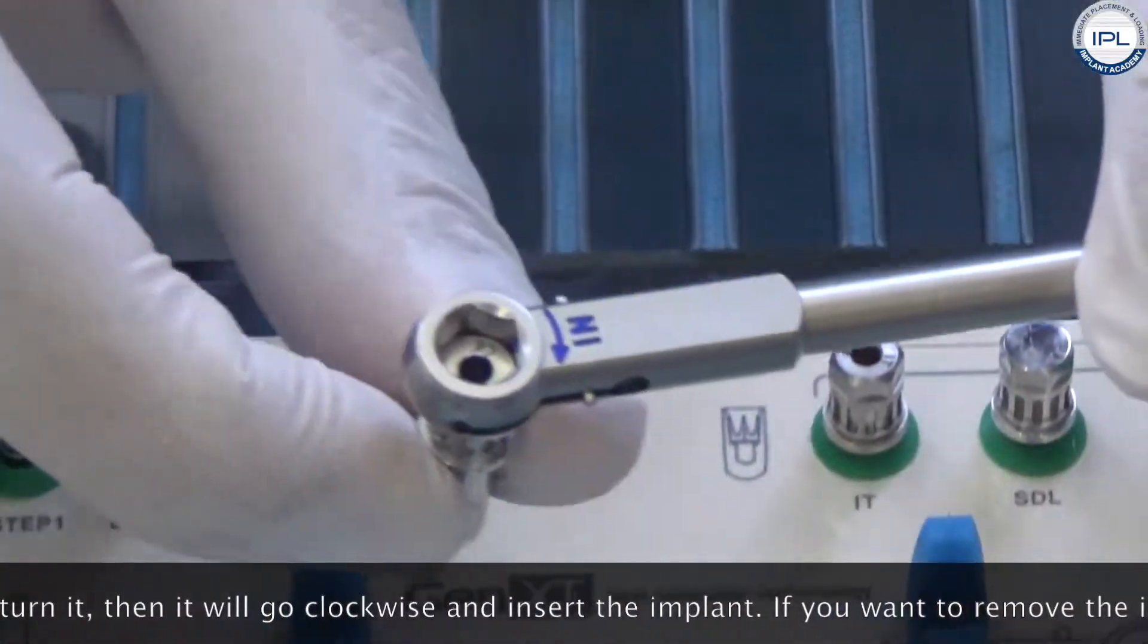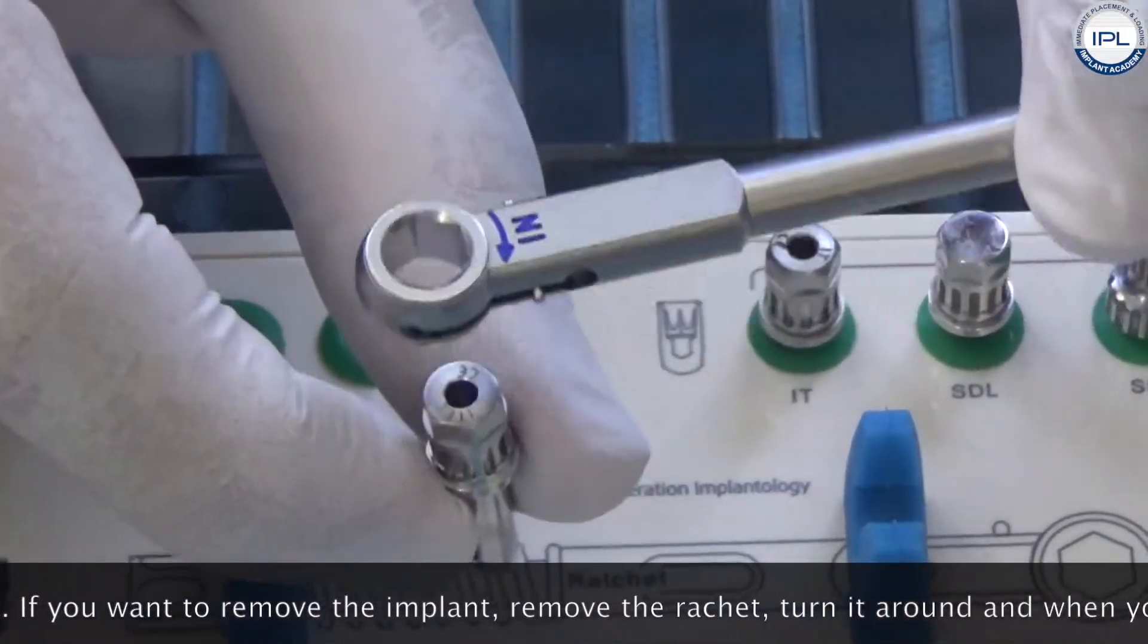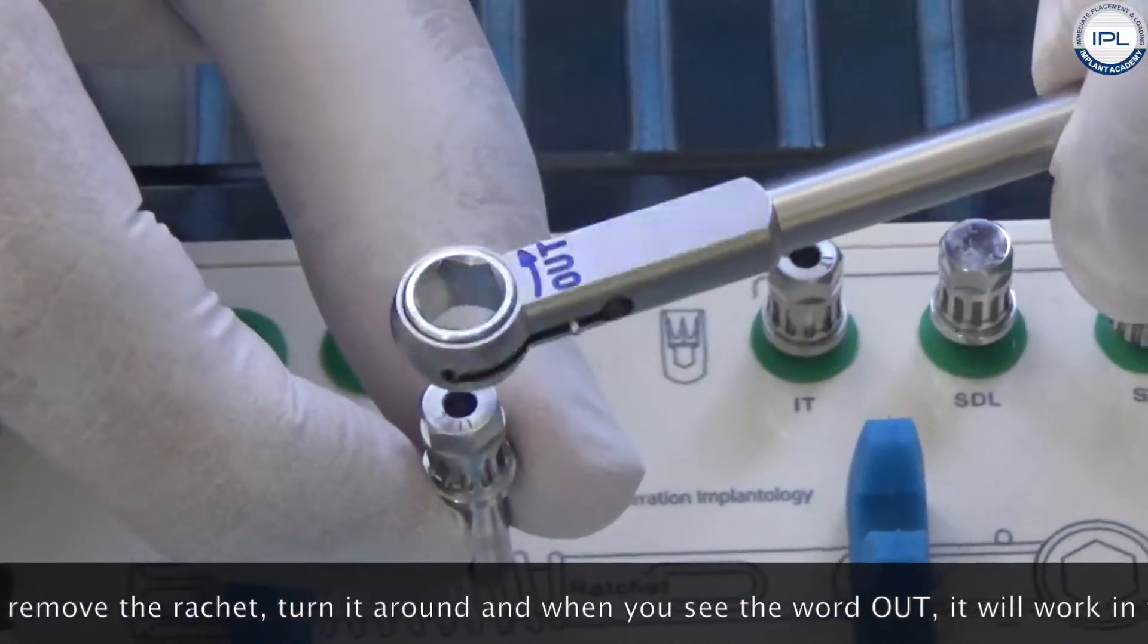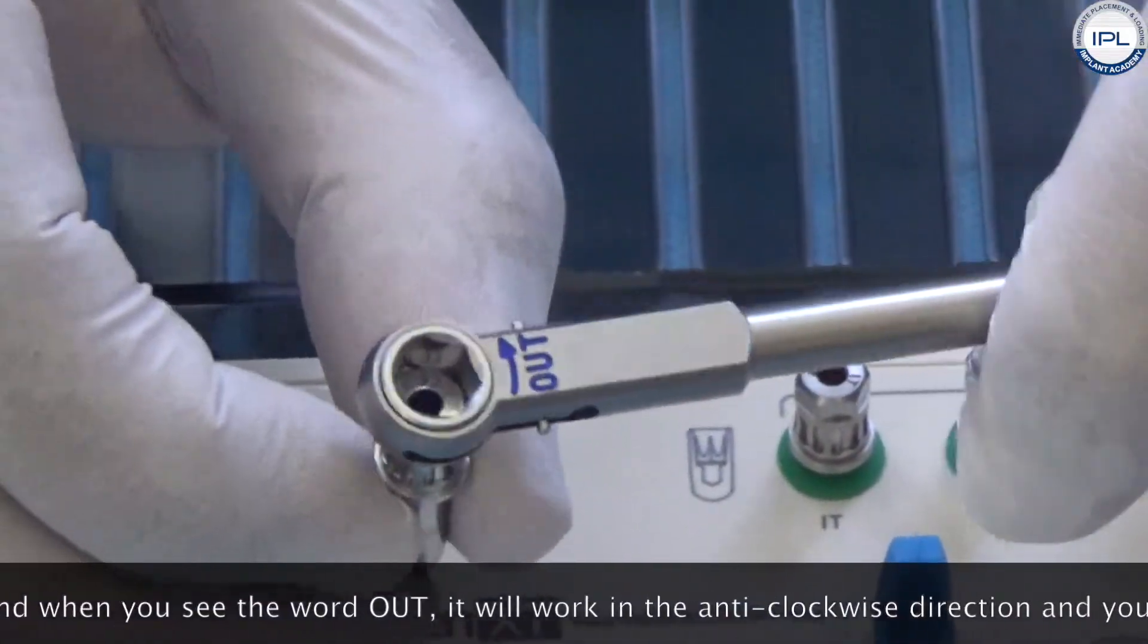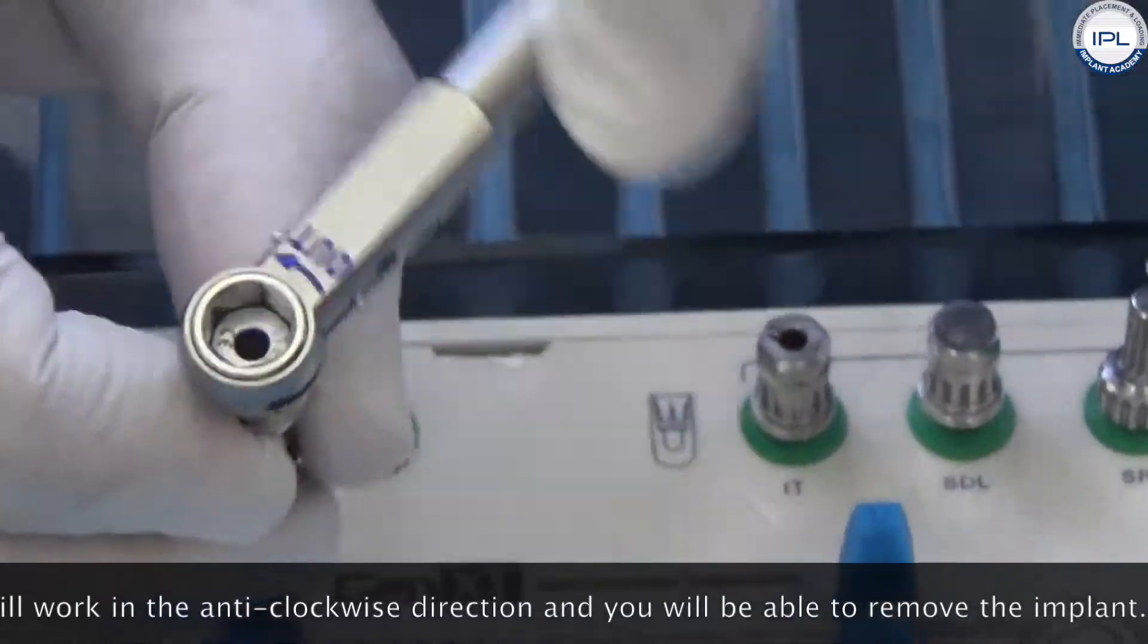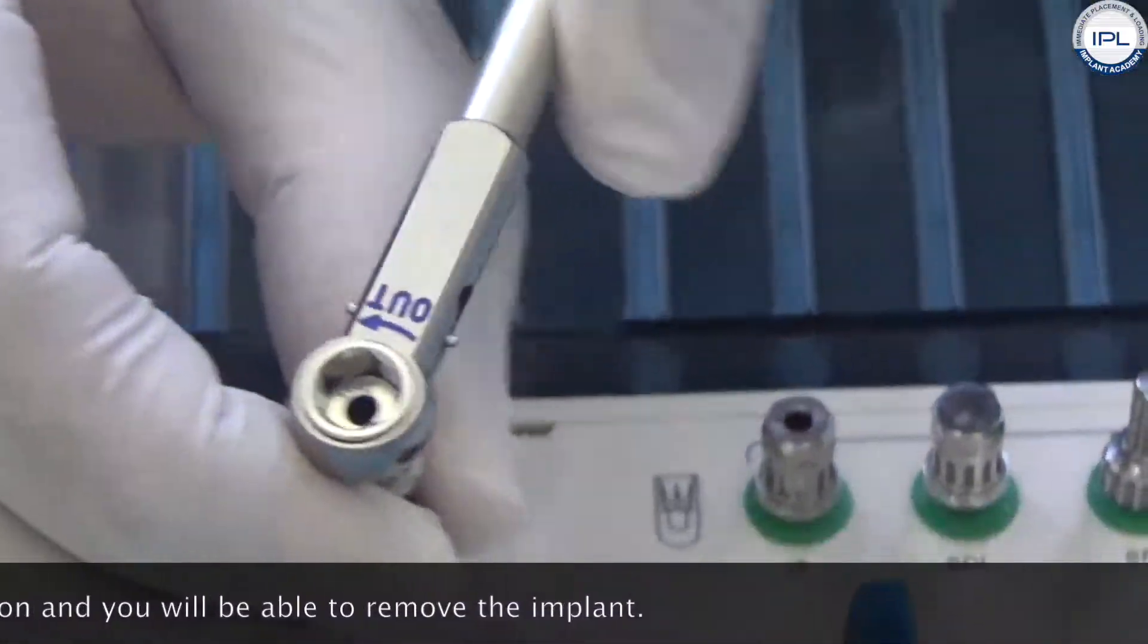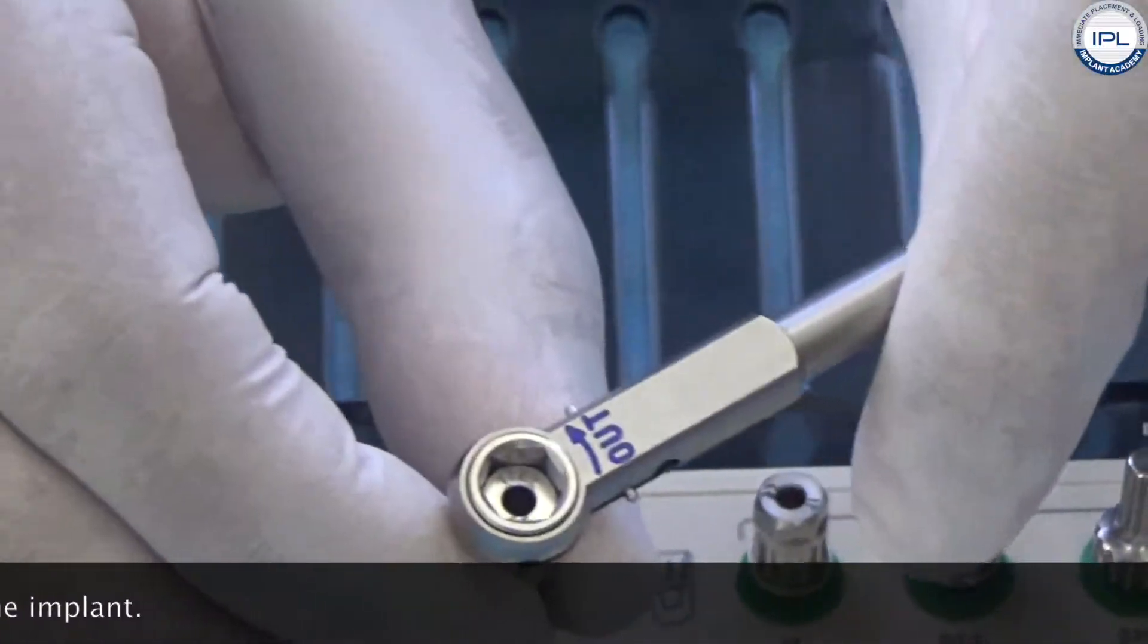If you want to remove the implant or you want to unscrew the implant for whatever reason, you remove the ratchet, turn it around, and when you see the word out it will then work in the anti-clockwise direction and you will be able to remove the implant.